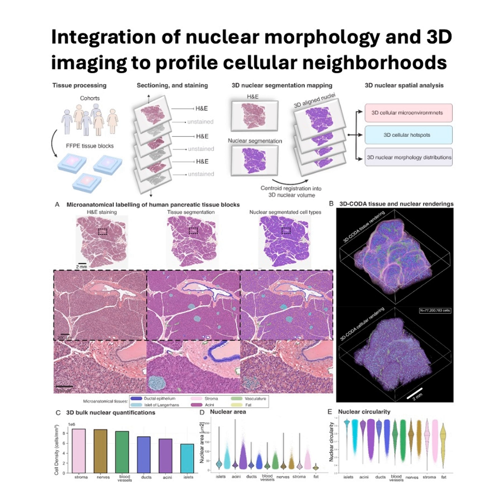Building a new dimension, the 3D imaging pipeline. So that question about stepping into the 3D universe, well, scientists at Johns Hopkins and NPOD have actually built the tech to do just that. Yes, they have. This paper introduces a novel and unified pipeline. It builds on an existing platform called CODA, right? That's correct. CODA stands for Comprehensive 3D Digital Anatomy. It's essentially a platform for 3D cellular imaging, designed to quantitatively reconstruct large tissue samples, but at a resolution where you can still see individual cells.